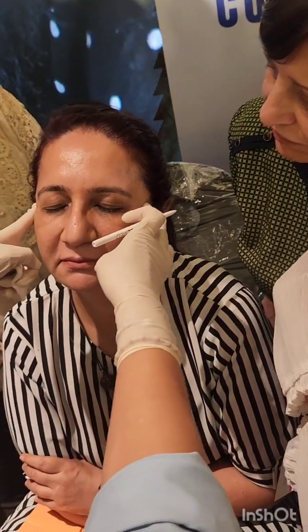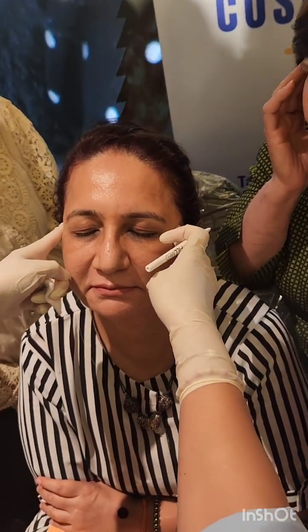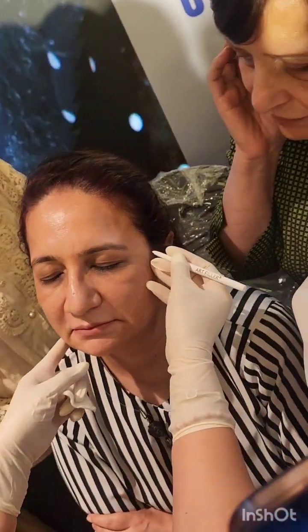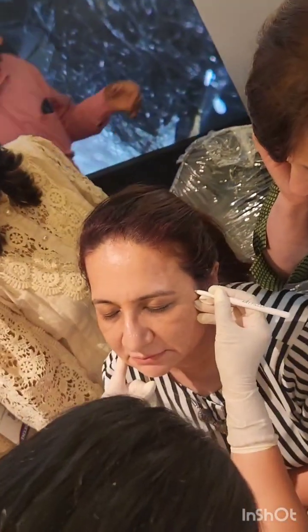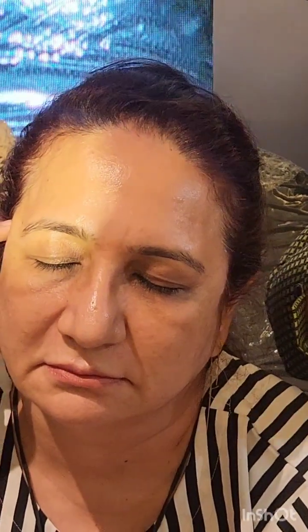So this is your zygoma, and here what is there? Zygomatic retaining ligament. So we will come from this side. So from this will be our entry point. Okay. From the bone, on the bone? No, over the bone, yeah. Or above the bone. So that. Now why I'm making this point, okay?